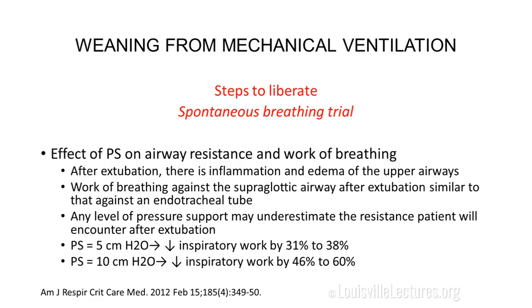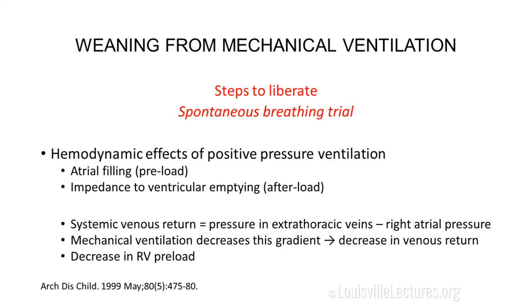So let's look at the effect of pressure support on airway resistance and work of breathing. After extubation, there's inflammation and edema of the upper airways. So the work of breathing against the supraglottic airway after extubation is similar to that against an endotracheal tube. So any level of pressure support may underestimate the resistance the patient is going to encounter once extubated. For instance, a pressure support of 5 decreases the inspiratory work by 31 to 38%. A pressure support of 10 decreases the inspiratory work by 46 to 60%.